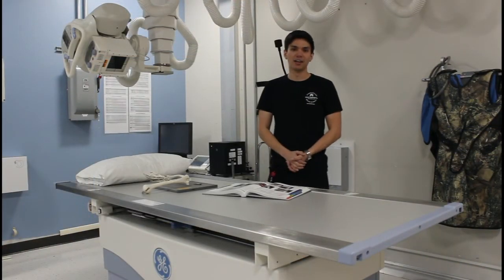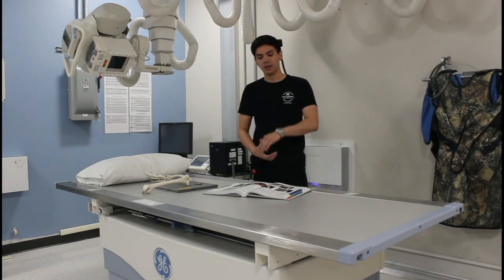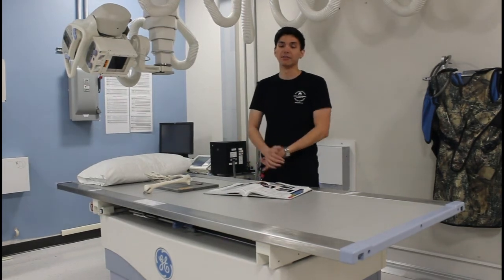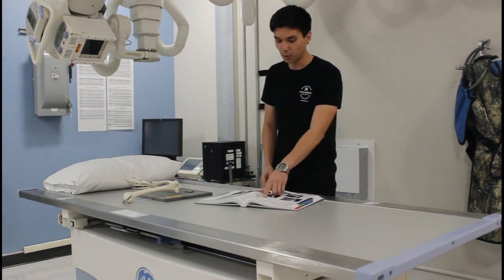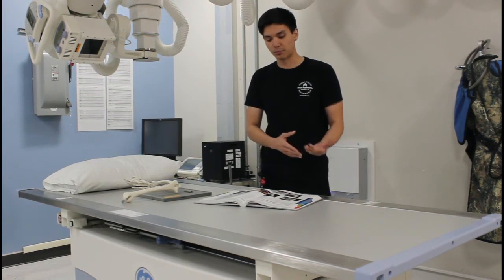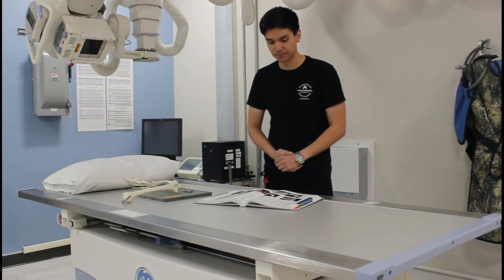Hi everyone. Again, we're here to go over the evaluation criteria for the coronoid process of the Coyle method. So the first thing that you would be looking for is, again, evidence of proper collimation and presence of a side marker. You want to look for that open joint space between the coronoid process and the trochlea. Again, that coronoid process should be in profile and elongated from the CR angulation.